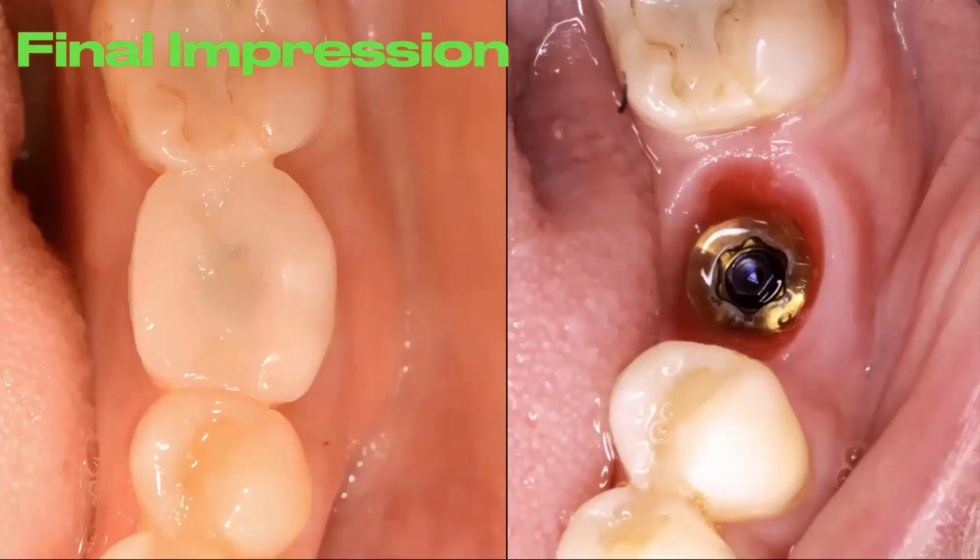We placed an abutment onto the implant, which is an on-one platform, which allows us to seal out the implant abutment connection the day of surgery and just work from this platform, kind of like a tissue level implant, but has the benefits of us removing this if we ever want to and go further to the implant head, which is really amazing. You can see by doing things atraumatically, but still respecting things, we give a really thick band of tissue to cause stability around the restoration and really provide us with what we want. And all that just is proof in the pudding. You know what I mean? And it really allows us to get what we want done.